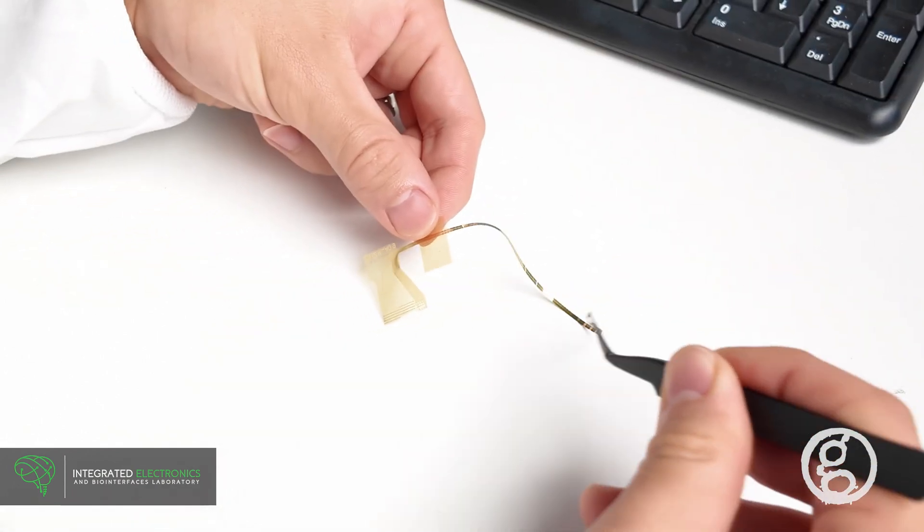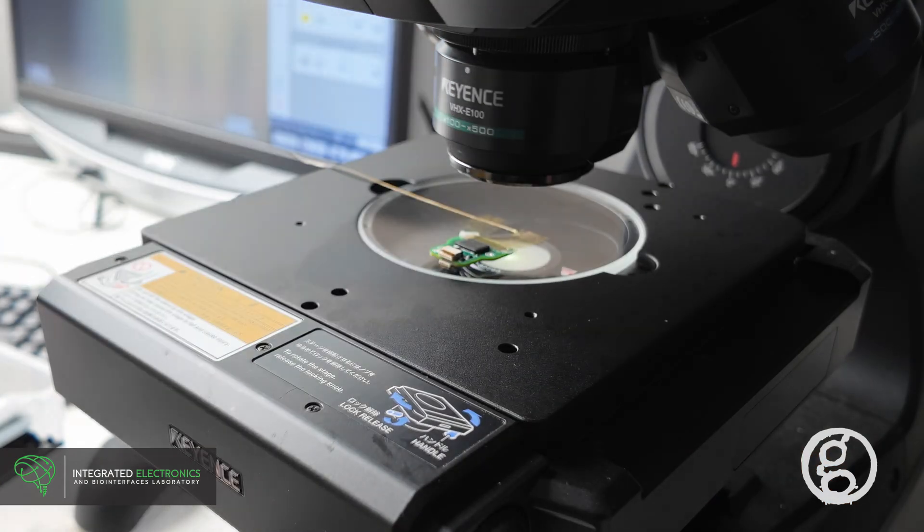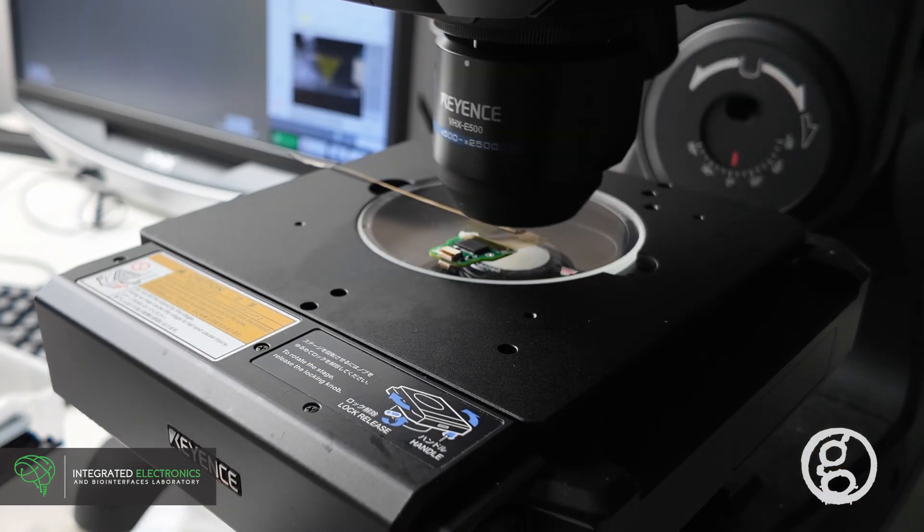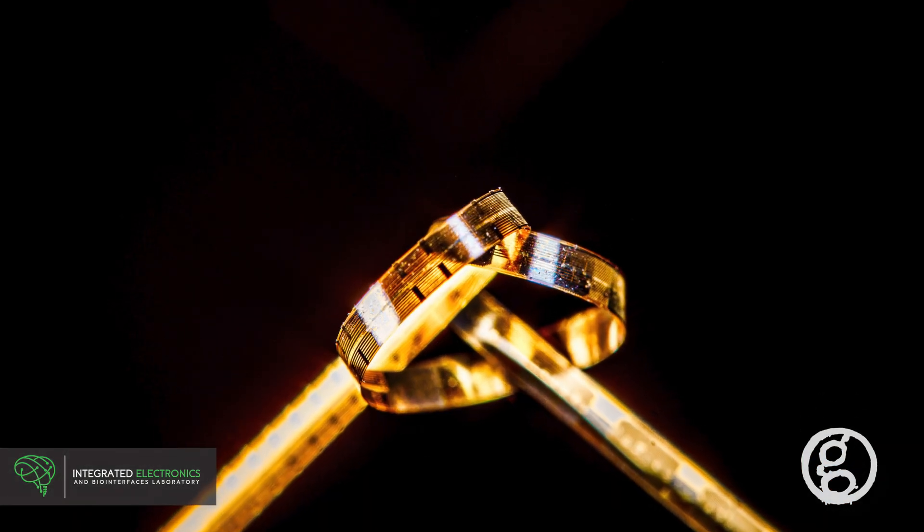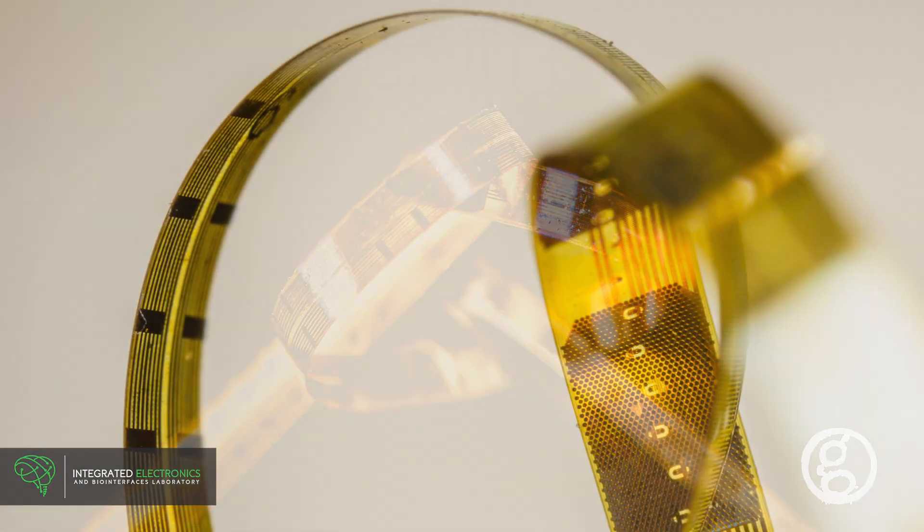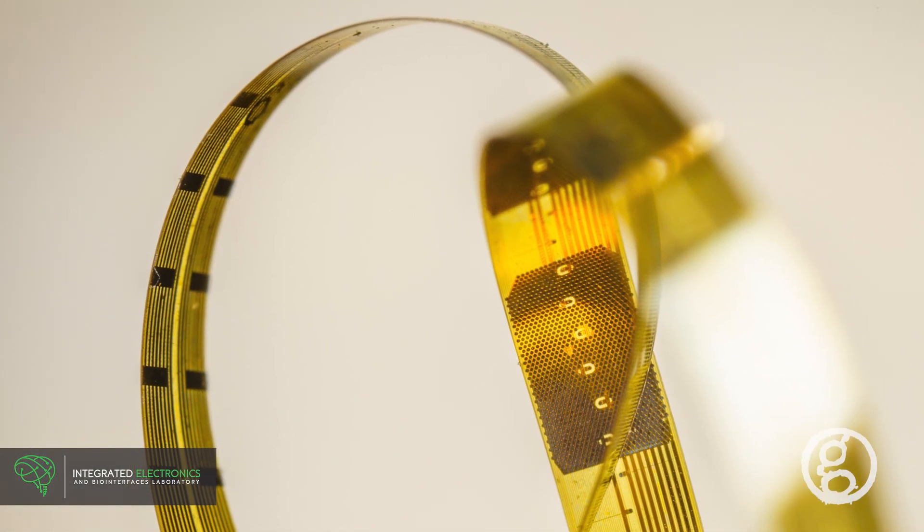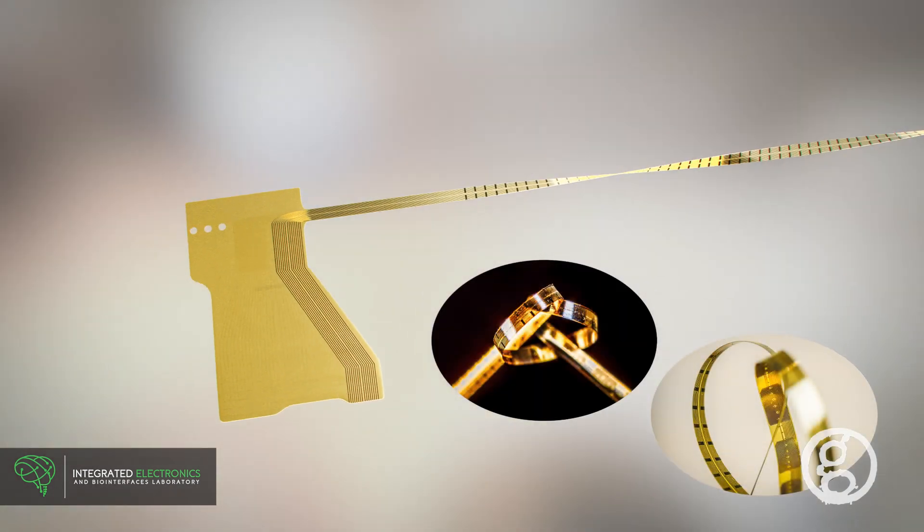It is ultra-thin and flexible. It has 128 microelectrodes which record brain activity. It also has 16 macroelectrodes that stimulate the brain with tiny pulses of electric current. This electrode is incredibly thin, just one-fifth the width of a human hair, and is highly flexible.